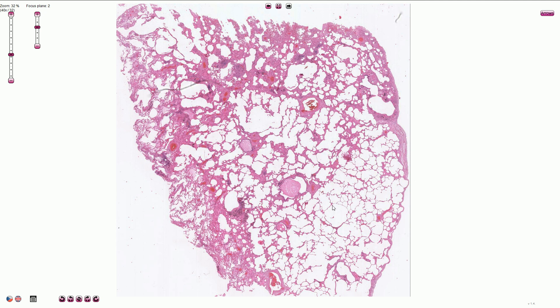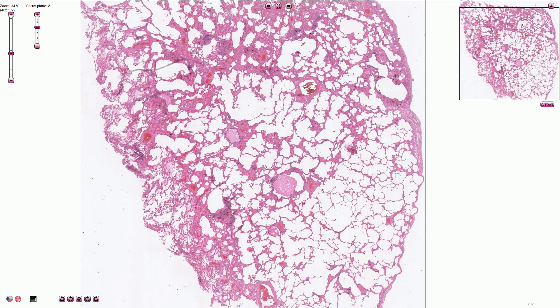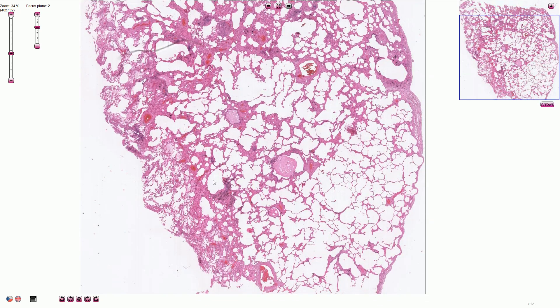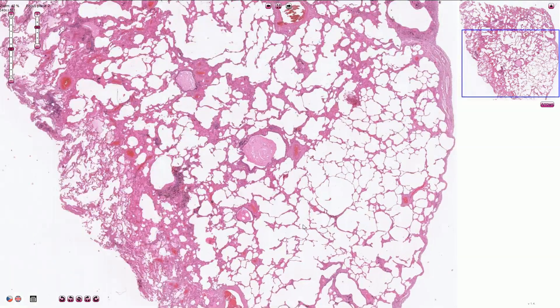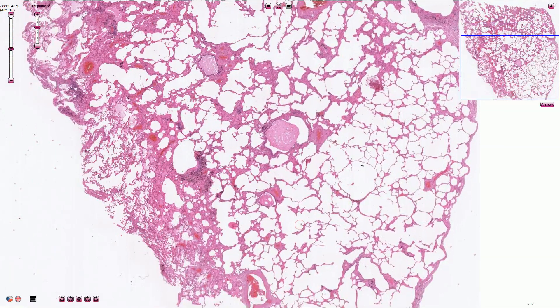Comparing this part of the pulmonary parenchyma, which looks more or less normal, with this emphysematous part, the alveolar spaces here are much wider and distended, and they are associated with very thin alveolar septi.